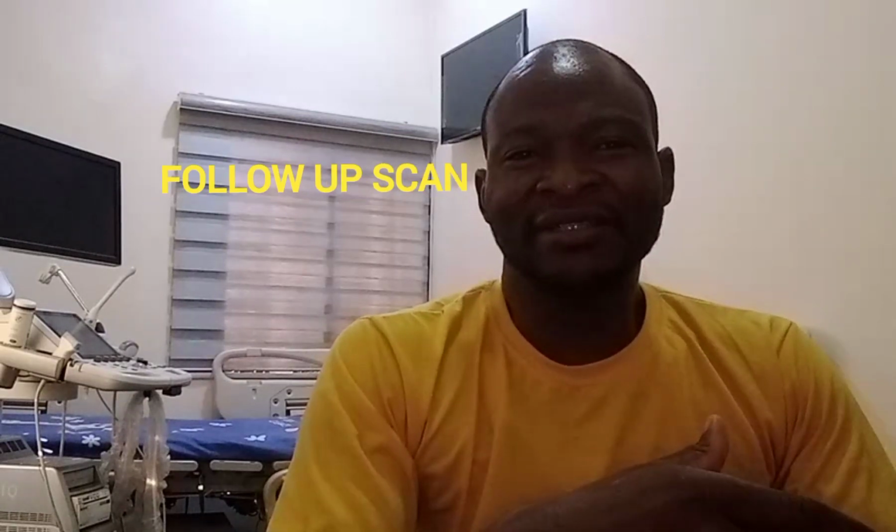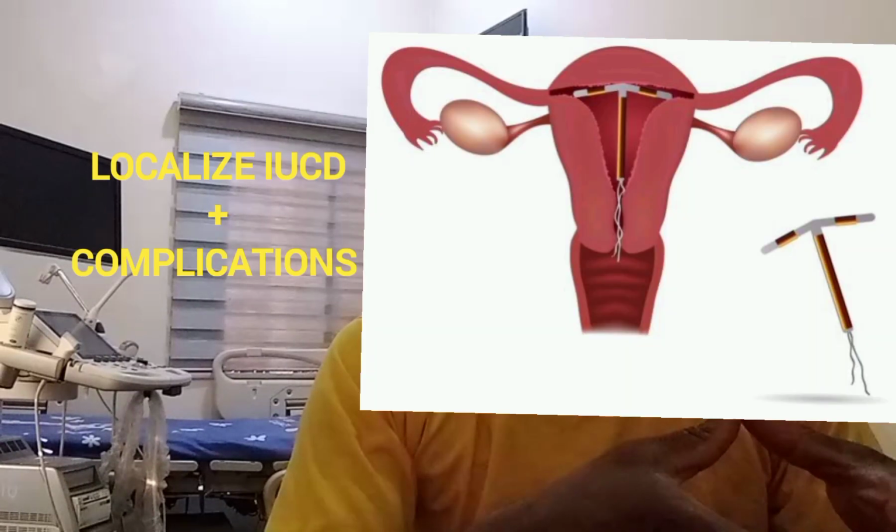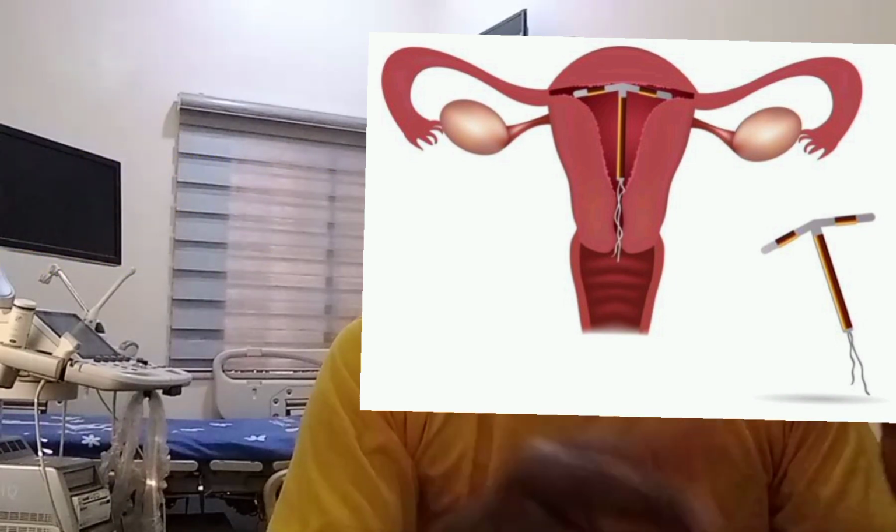Follow-up of previously detected abnormality, like hemorrhagic corpus luteum cysts or any other cysts that were noted in the previous scan. You do pelvic ultrasound to localize an IUCD, intrauterine contraceptive device, and any other complication around it.